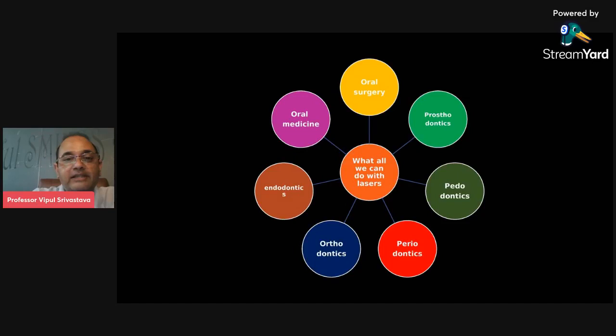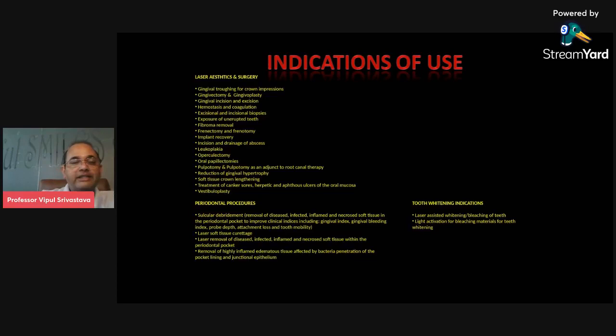Like I already discussed, laser has application in oral surgery, prosthodontics, pedodontics, periodontics, orthodontics, endodontics, and oral medicine. Before that, these are some soft tissue indications of lasers, like laser aesthetics and surgery, and laser can be used in gingival procedures. All these slides I will be sharing with Woodpecker, and you can always ask them for the applications. These are all FDA approved applications. We have almost 40 soft tissue laser applications FDA approved. There are some indications which are yet to be approved by FDA, but I have used laser successfully.